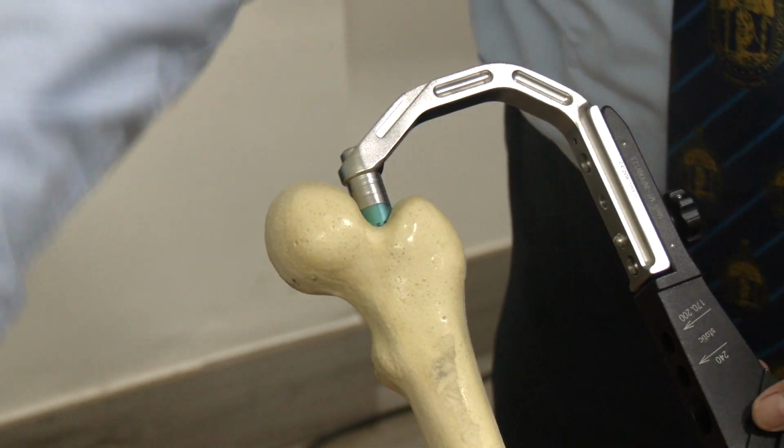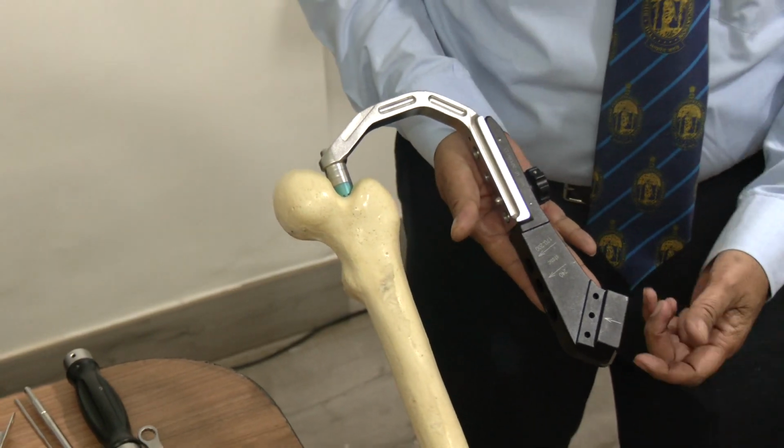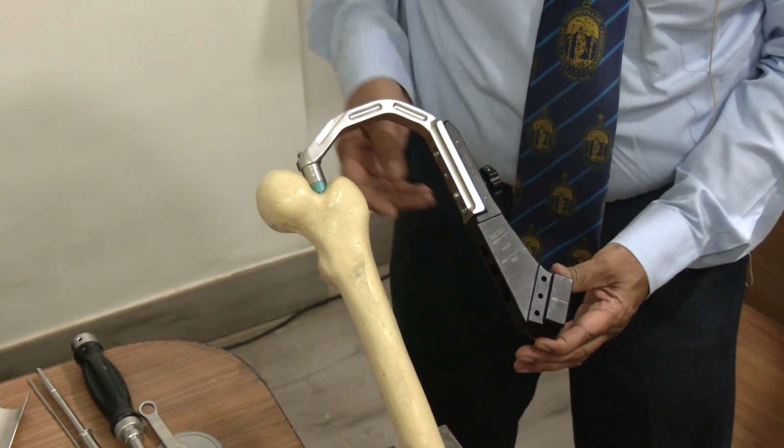Since I don't have the CM here, I'll use the sleeve here. Give the sleeve.